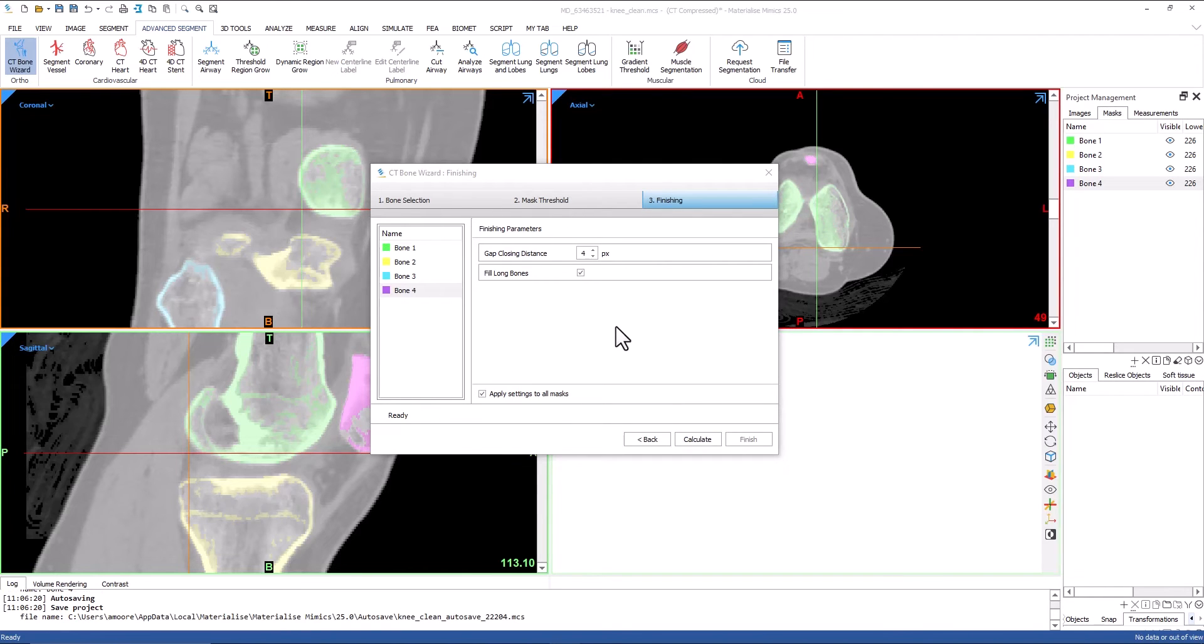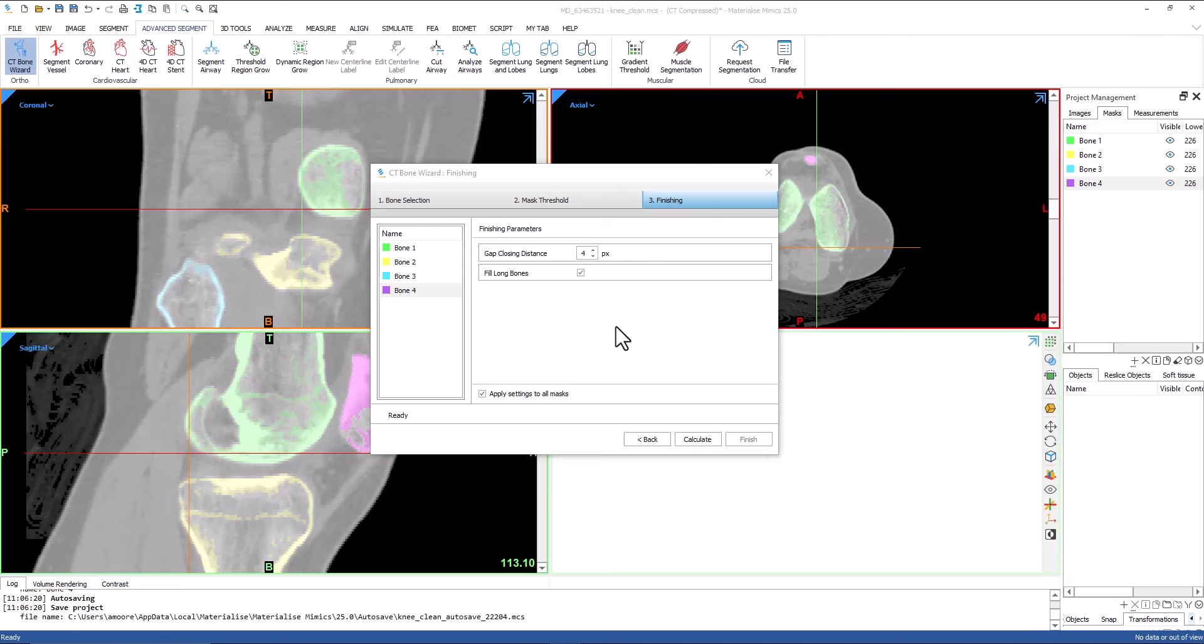The third and final step of the CT Bone Wizard tool is finishing. This step is used to perform post-processing on the newly created masks, including filling and fine tuning of the contours. Using the gap closing distance will define a zone around the mask where an additional analysis of the pixels will be performed. If the tool believes there is a high probability of a pixel being part of the bone, it will be added to the mask.